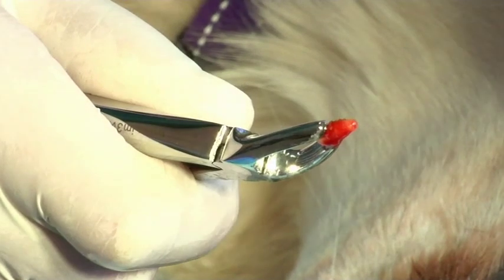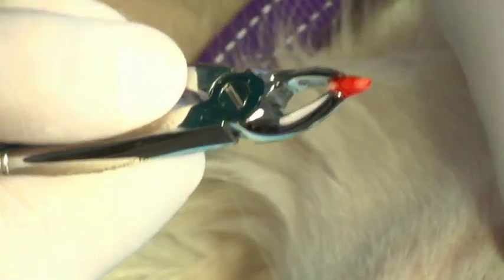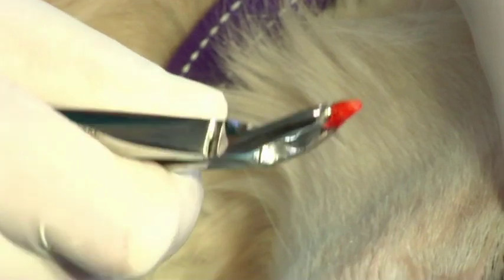When the tooth is extracted, check the apex. The apex should be smooth and rounded.